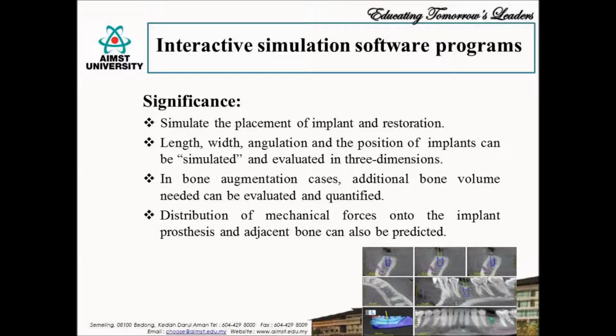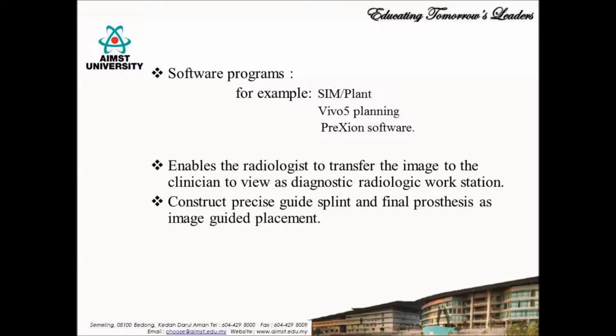The restoration of the implant can also be simulated, along with the distribution of the mechanical forces onto the implant and also onto the adjacent bone. These also can be predicted with these software.